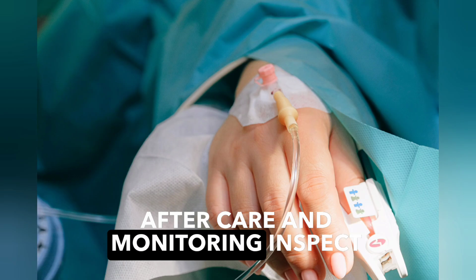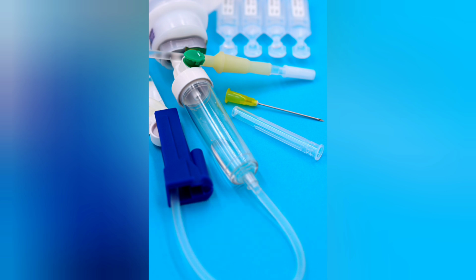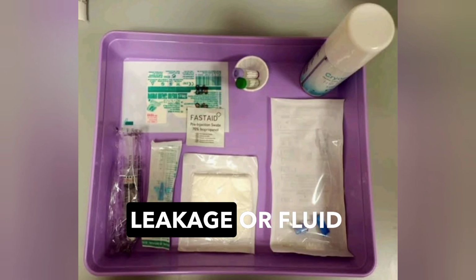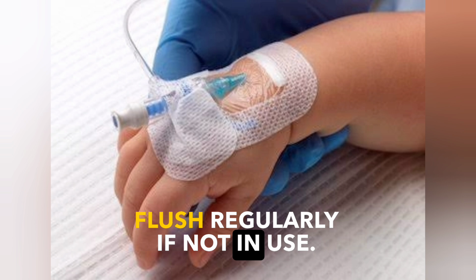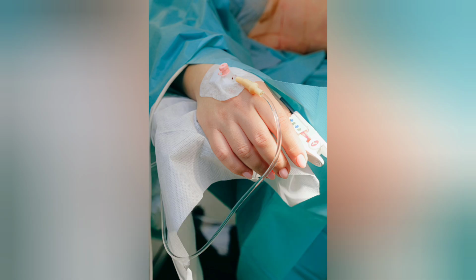Aftercare and monitoring. Inspect the site every 2 to 4 hours for redness, swelling, or pain, which indicate phlebitis or infiltration. Check for leakage or fluid pooling around the site. Ensure the line remains patent. Flush regularly if not in use. Assess for complications, like fever or discomfort.